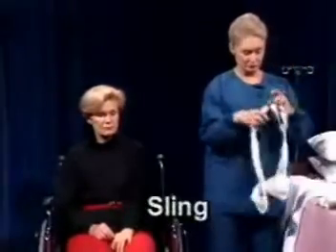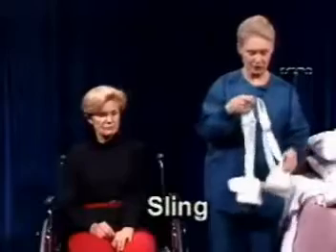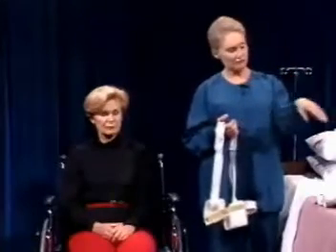Okay, we can remove this piece, and we're going to next be looking at a commonly used, although very complicated, sling. First, we should say a few things about slings generally, and that's that a sling is used to support a patient's upper extremity or arm. It's used with a variety of diagnoses, included, again, a patient that's had a stroke that has no functional use of their arm. In that case, it would help support their shoulder in the socket, give support to their wrist that generally is in this type of flaccid, we call it, position. There is no control. It's used for patients with dislocated shoulders or rotator cuff tears, or even patients with mild fractures. I brought this sling today because it's probably the most complicated of all the slings that you will see.